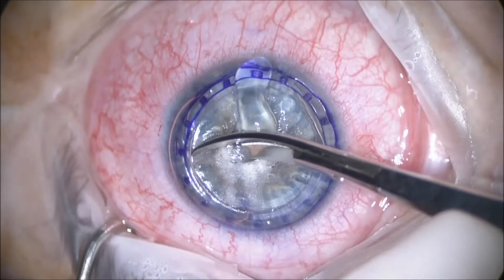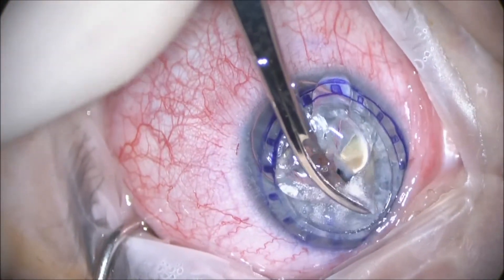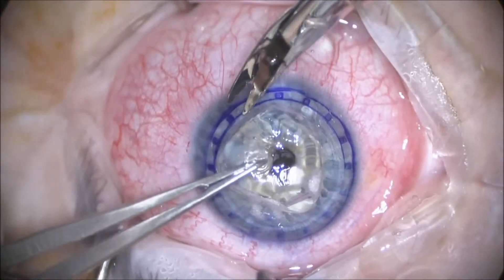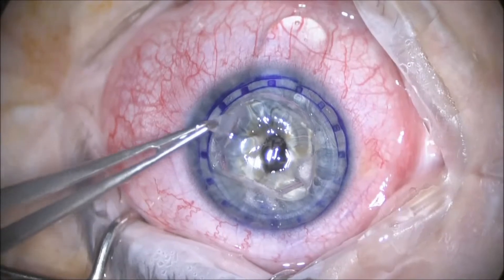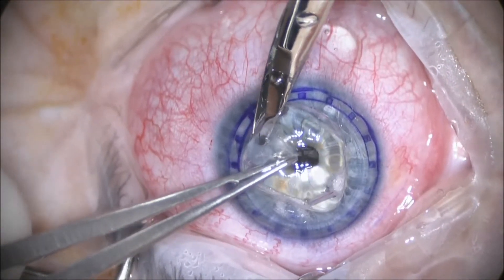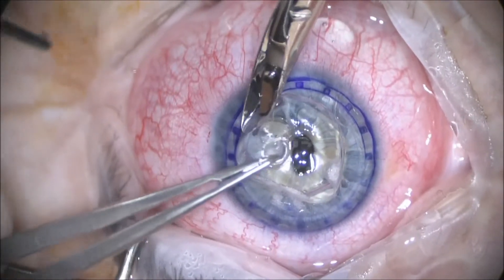Once that lamellar section is complete, we're using Boggs scissors here to basically make a cruciate incision. Subsequently, we remove the four pie-shaped stromal segments overlying Descemet's membrane.